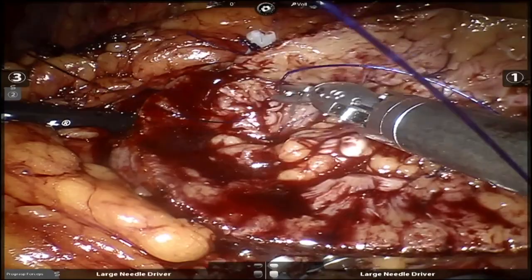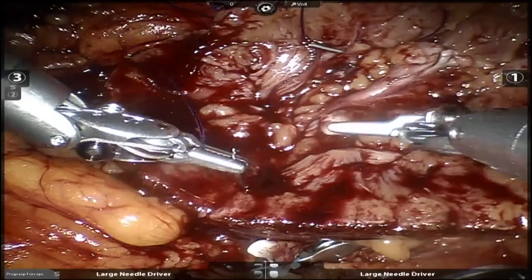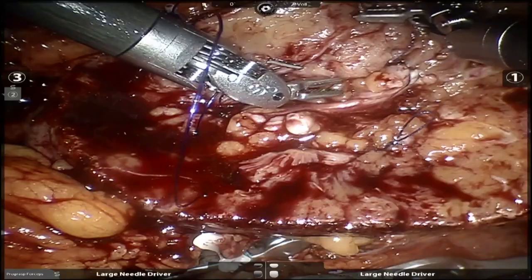So this is a 0 PDS? No, it's a 3-0 PDS. We usually use a monocryl, but we just need some absorbable monofilament suture. This is what a lot of people use with the V-Loc. I like this monofilament better. What I'm trying to do here is reapproximate the medullary tissues over the sinus. That closes the dead space of the deep defect, and at the same time gets some of these venous sinuses that might be open. If you take one suture, it pulls through. But if you take multiple sutures, like I'm going to show you here, and then sequentially cinch it down, then it works.